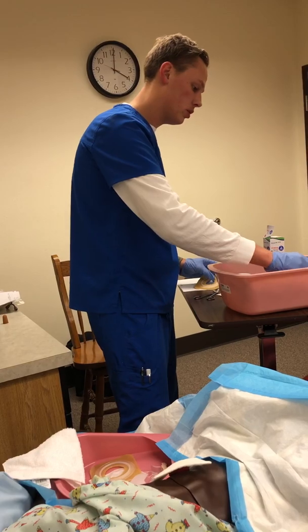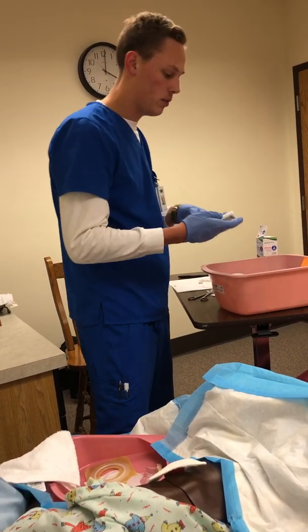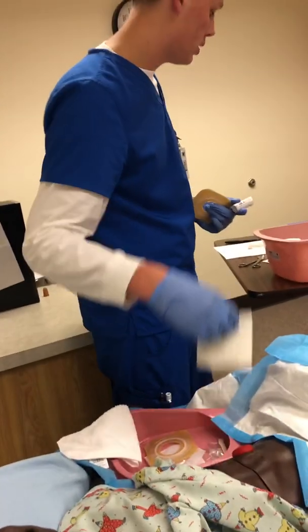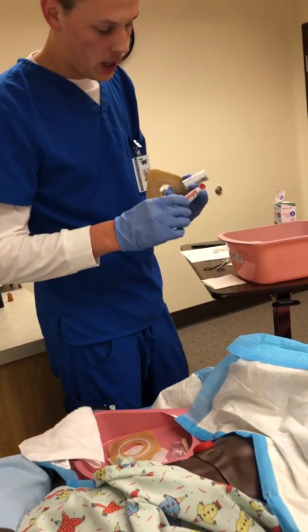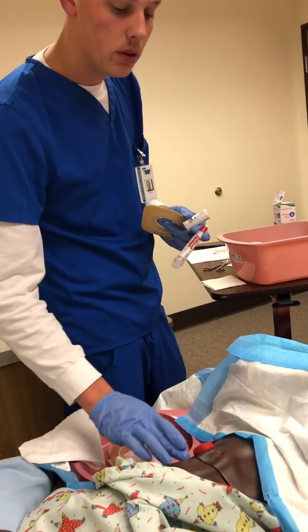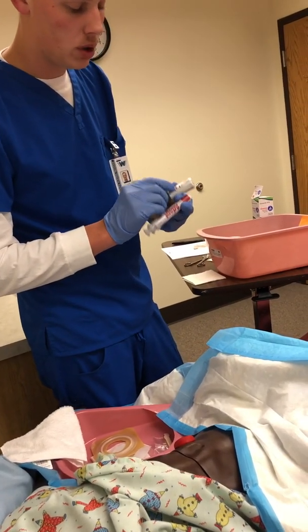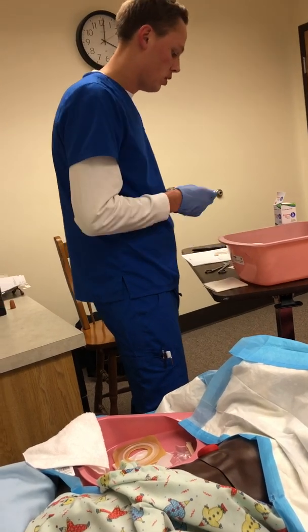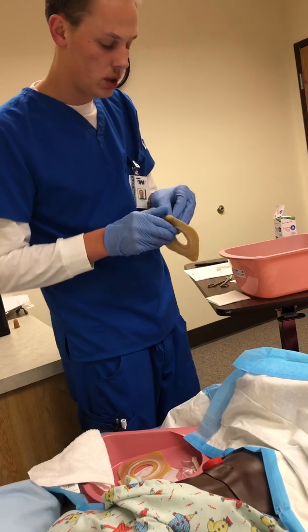So then I will go ahead and, before putting it on, I will put the Adapt paste around the stoma, and then I would put the Adapt stoma powder onto the stoma so that it isn't getting inflamed or anything, so it doesn't start burning.